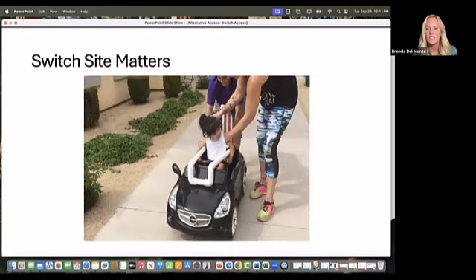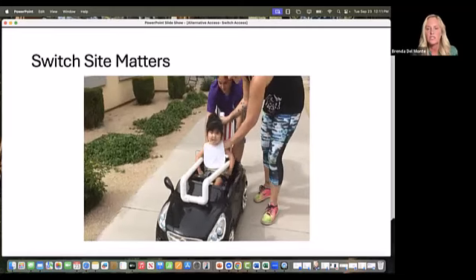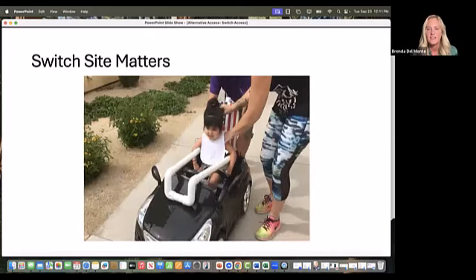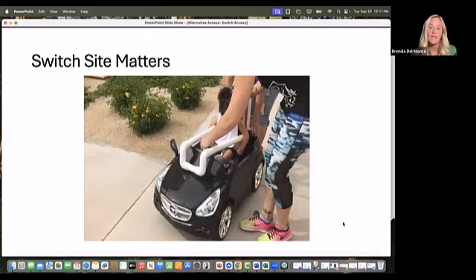And it's a much easier skill. All we're doing right there is supporting her shoulder so she doesn't get whiplash when she's driving the car. So that gives you a really good sense of how the head switch can create great posture and sets her up for educational and social success because she's at least sitting up and looking around.